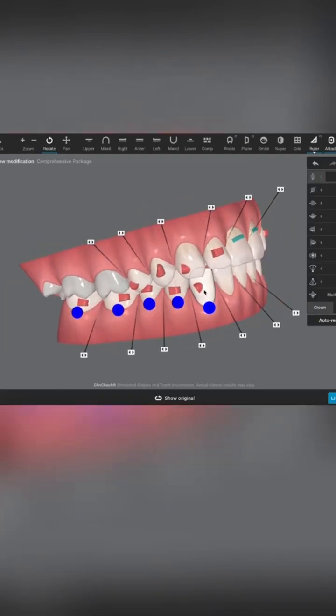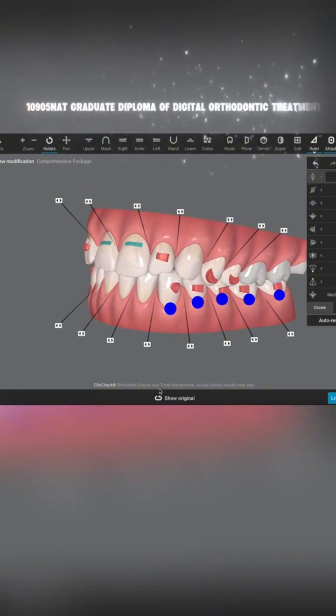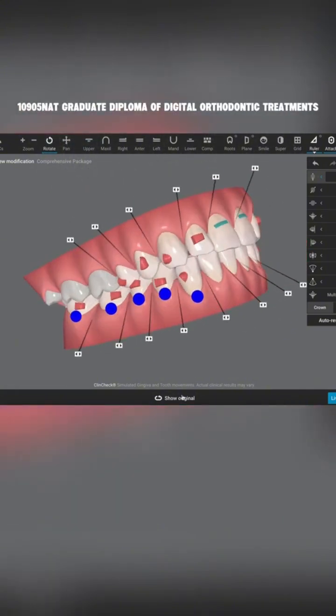I'll just change this attachment — three, three and four, three — to horizontals, or maybe even verticals, because there's a bit of tipping.